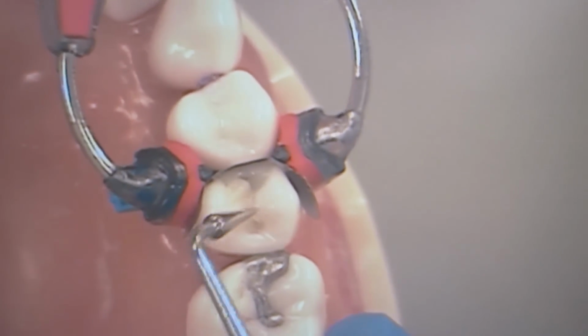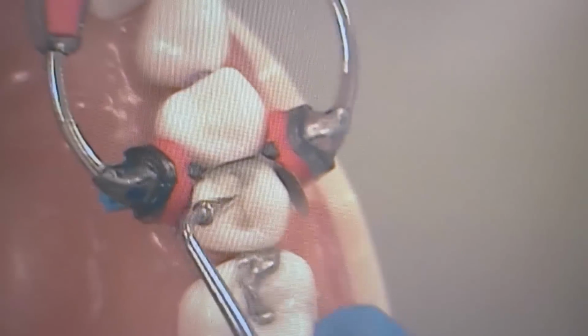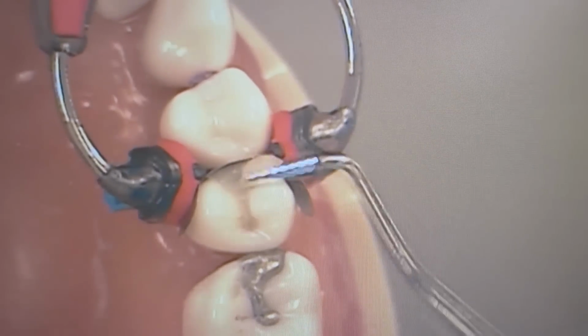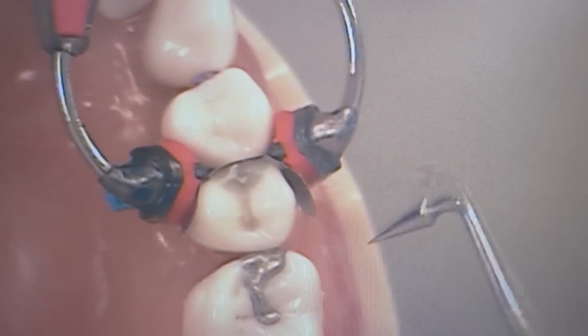So now the tip of that just rides on the composite. So the tip is riding on the composite on the other side. So basically, you're just following that central groove, shaping it. Got that anatomy going in.